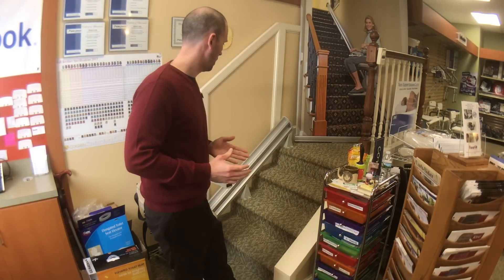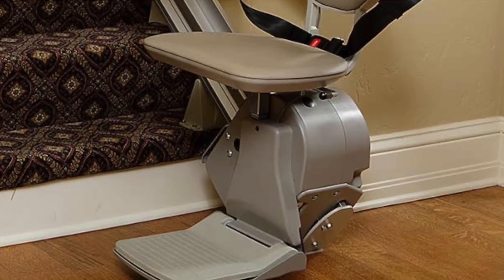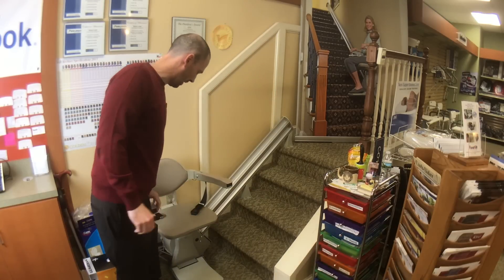We'll be going over the Bruno Elan Stair Lift, the most popular stair lift that Bruno does for straight rails. I'll give you a quick look at it.